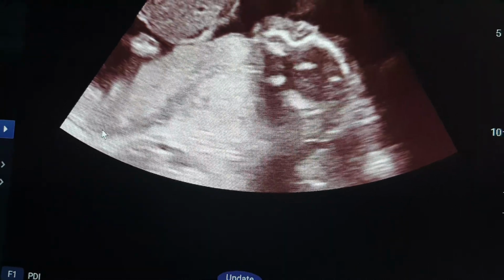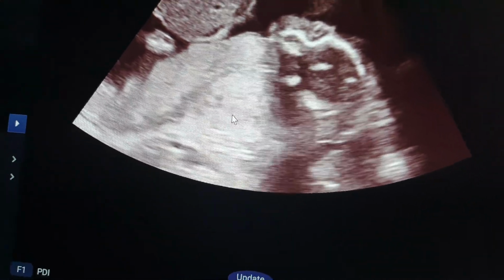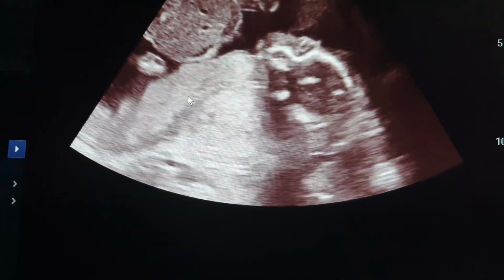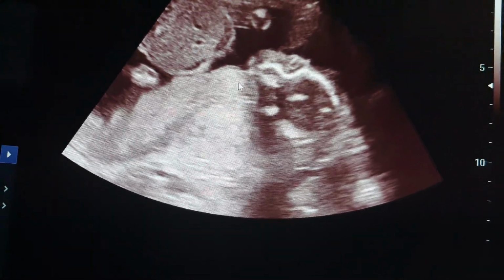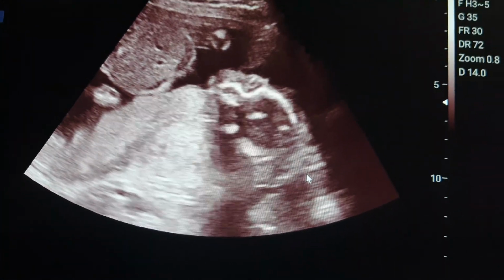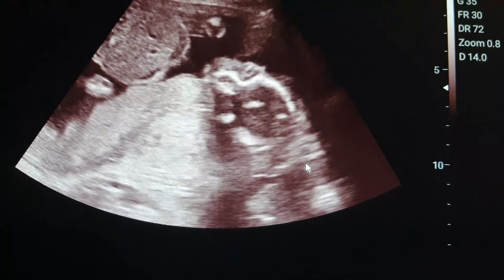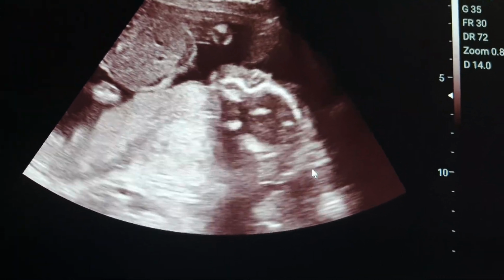So this is the placenta, and that rising of the placenta is a uterine contraction. It's a posterior uterine wall contraction, and the placenta is posterior, and the placenta ended very high here. So it's away from the internal os. But of course, if you want to be sure, you should see the internal os, and be sure that the placenta is not reaching the internal os, either anterior or posterior.